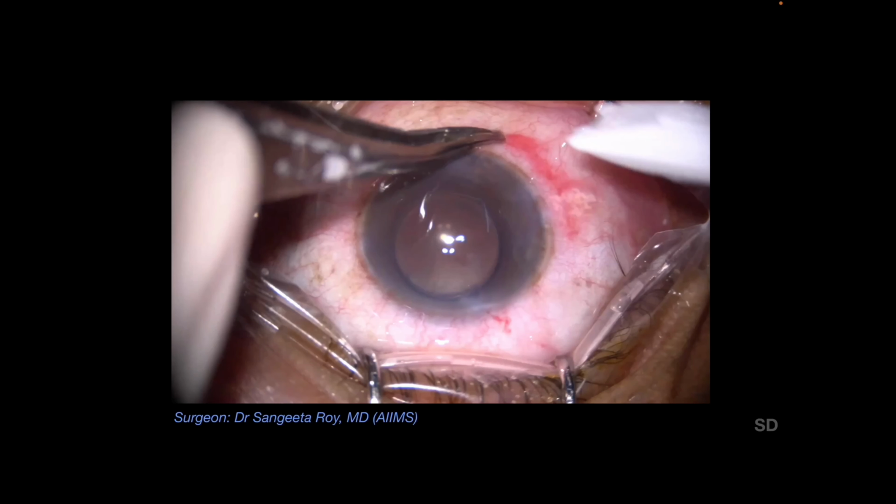We have a few video clips here, and we must note that although the view of the anterior segment in these videos is upright, the view of the posterior segment in these videos is inverted both horizontally and vertically, but the surgeon's view of the posterior segment through the eyepieces of the microscope remains upright because of SDI.